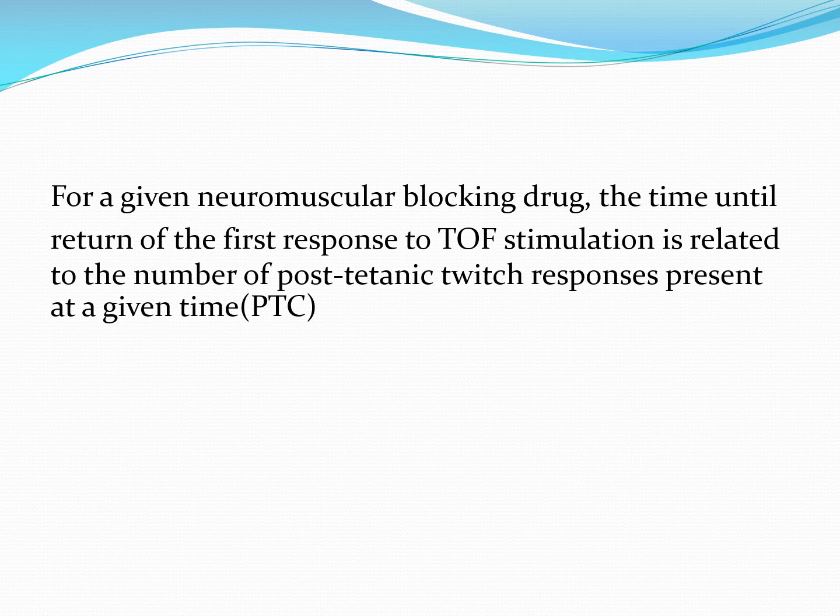For a given muscle relaxant, the time until the return of the first response to train of four stimulation is related to the number of post-tetanic twitch responses present at a given time. It's called post-tetanic count.